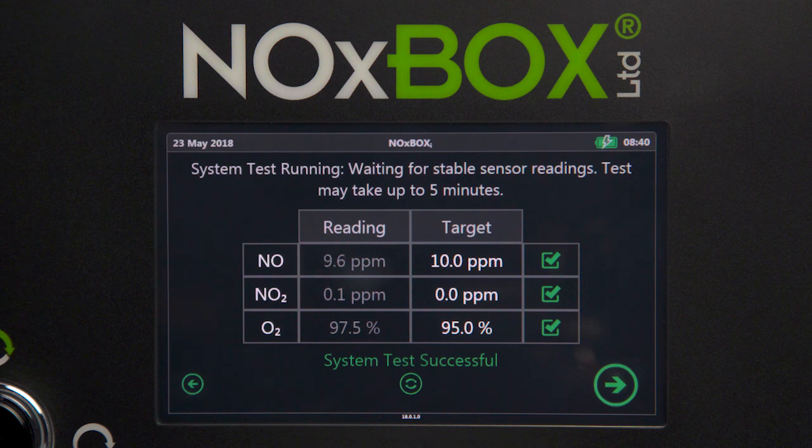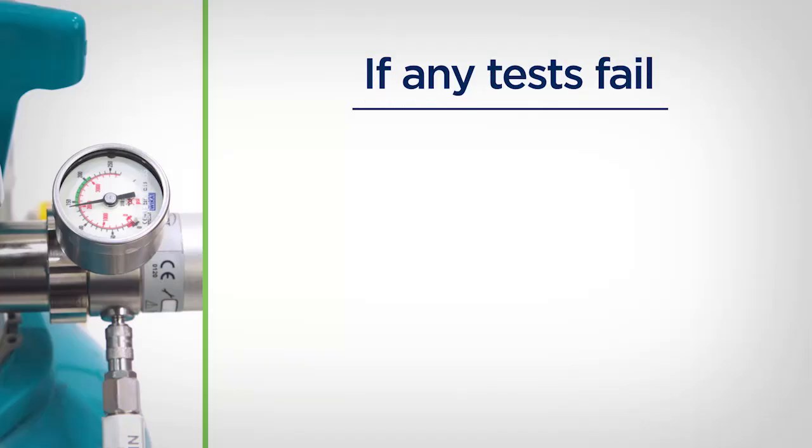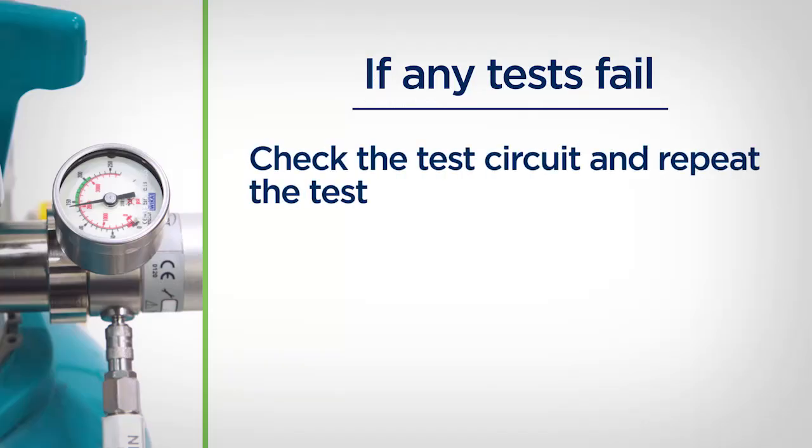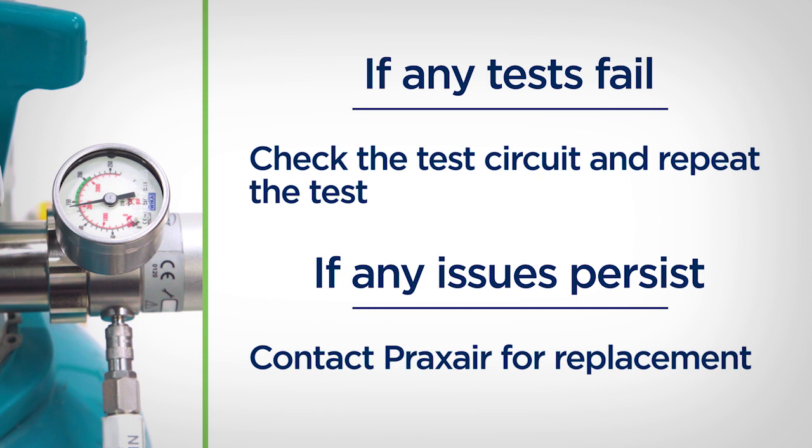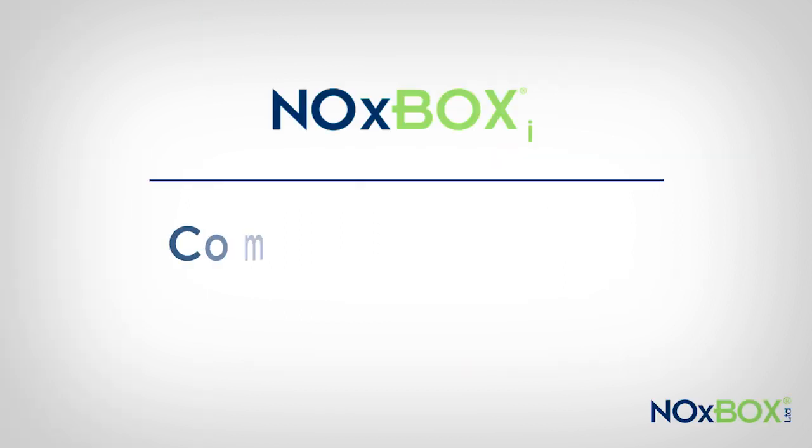If you're not connecting to a patient right away, the NOxBOXi system should be placed in standby mode. If any of the tests fail, check for issues in the test circuit setup and repeat the test. If issues persist, contact PraxAir to replace the NOxBOXi system.